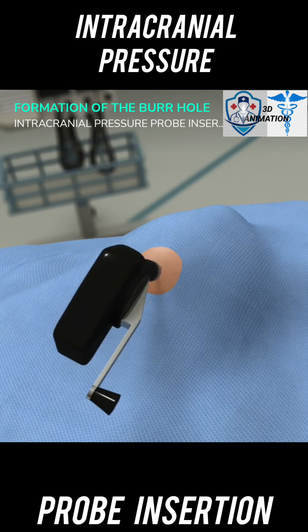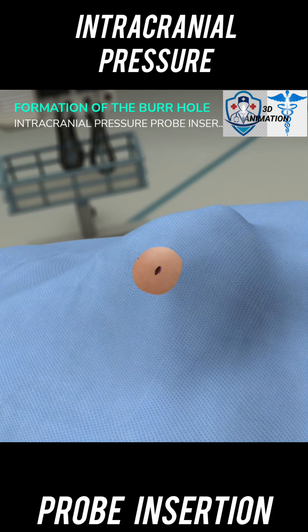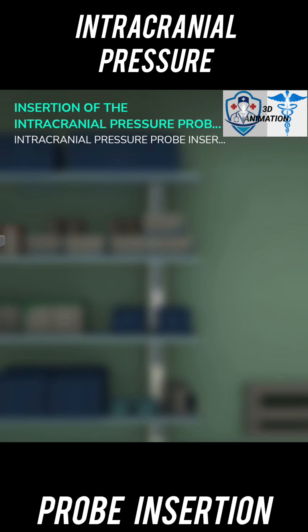Use the scalpel to make a 1-centimeter stab incision at the insertion site, then use the drill to drill through the skull at a perpendicular angle. Use drill threads to check skull thickness, which is usually 5 to 10 millimeters in adults and determines bolt stop depth. Use forceps to probe the burr hole and remove any residual bone fragments, ensuring there is adequate opening to place the monitor. Use the 18-gauge needle to lacerate the underlying dura.